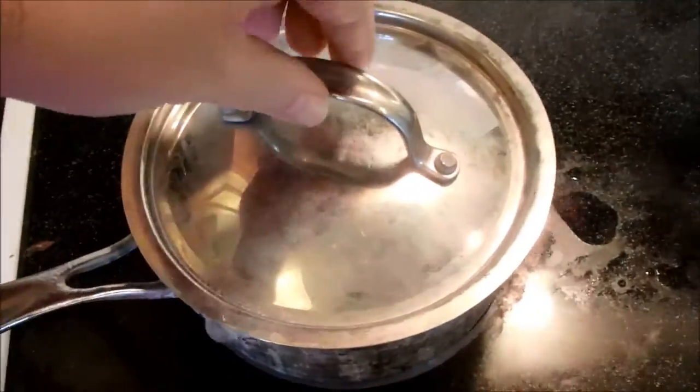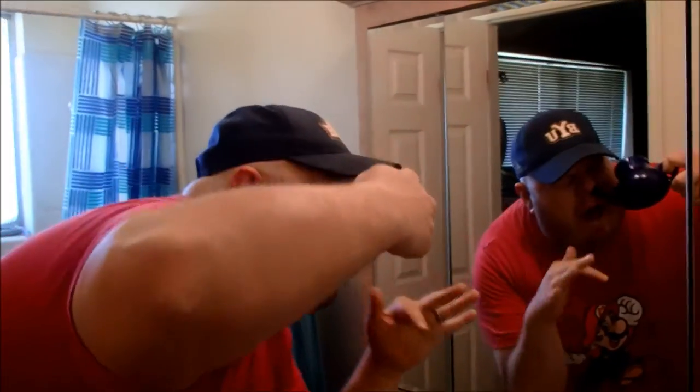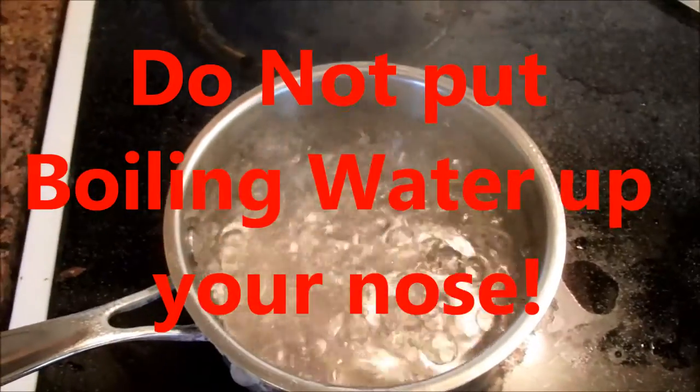The water we're boiling is for the neti pot — don't use pasta water in your neti pot, no pasta water, not good. Okay, it's boiling. So I put our hot boiling water here in the neti pot... just kidding, do NOT put boiling water in your neti pot. You will burn your nose. You will melt the neti pot. No boiling water.